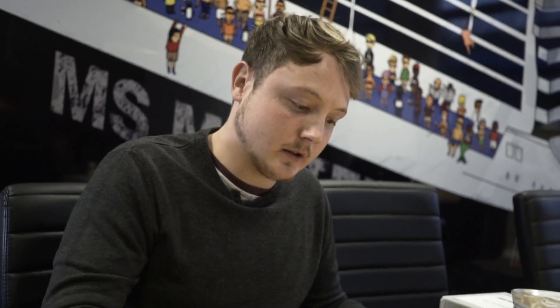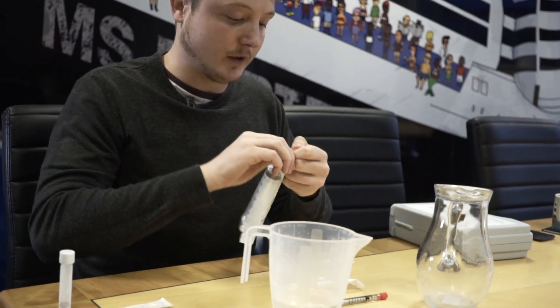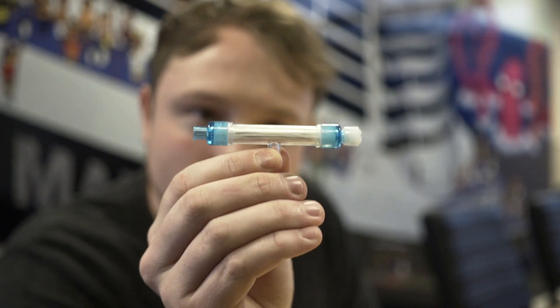We've got the syringe, we've got the filter, and then we've got another syringe here. So how it works: 250 ml of sample water. What we're going to do is put it through into the filter. On the filter itself you can see we've got two ends — one with a white cap and one empty.